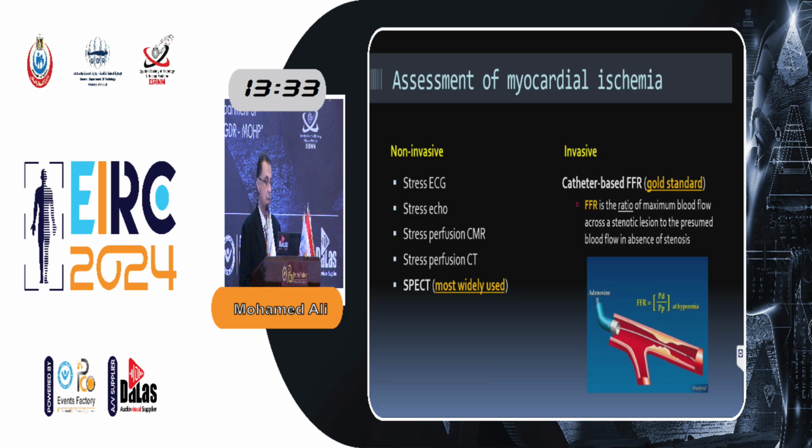The invasive assessment is the catheter-based FFR. The catheter-based FFR is the gold standard technique for evaluation of the lesion-related ischemia. FFR is a ratio between the maximum flow across a stenotic lesion to the presumed flow in absence of stenosis.